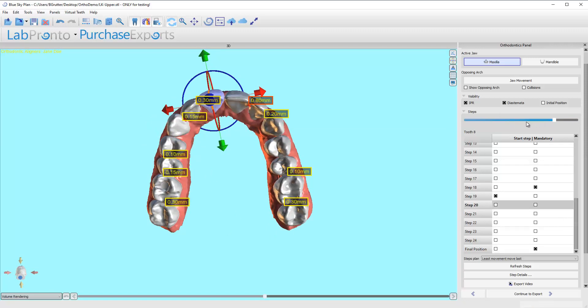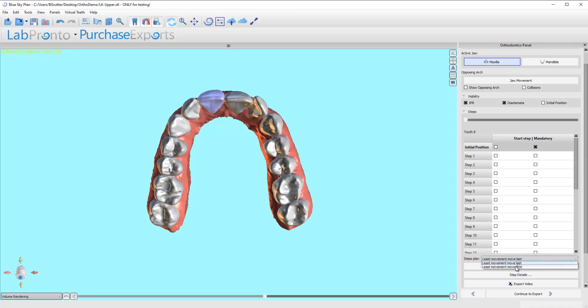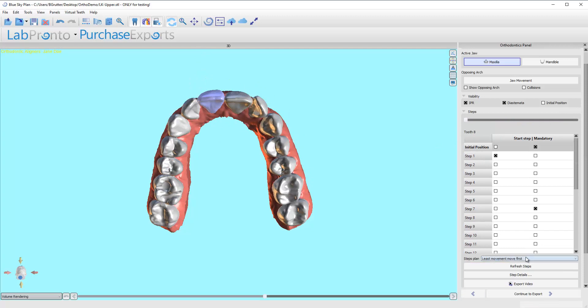How are these teeth moving? One of the things this software does is the default is to have least movement last, which means that whatever tooth moves the least, it's going to wait to do that to the very end. We can also change that to least movement first, so everything starts moving right away, which can sometimes help certain things or hurt other things. Let's take a look back at what it looked like when we had least movement first.